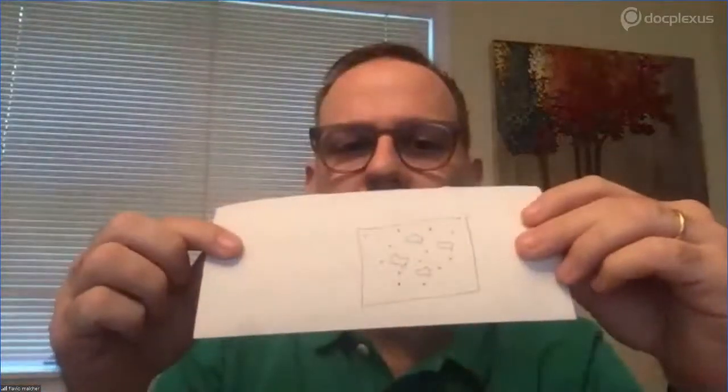And the second question? How to manage pro-grip mesh to prevent it getting stuck to the other areas? Yes, pro-grip, I enjoy pro-grip for those small defects. I like the 4 folds technique. So I got the pro-grip. The grips are outside. I fold it in 4 folds. So I open little by little. See 4 folds? So I open little by little. I put it closed. I touch the wall and I start to open little by little until I have the full mesh open.